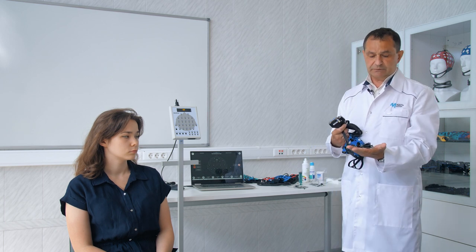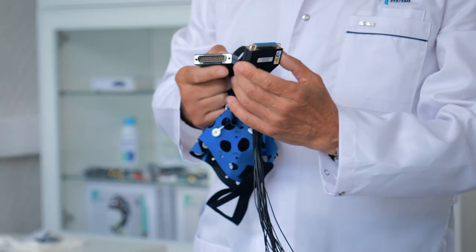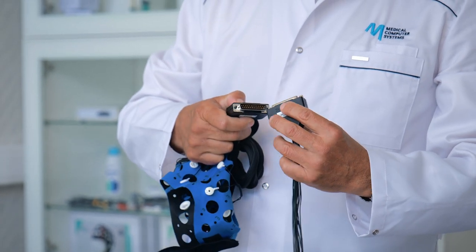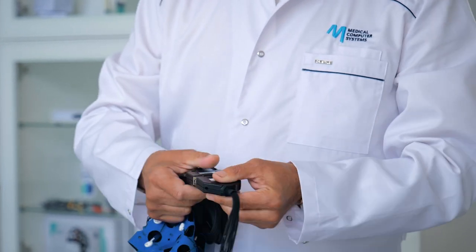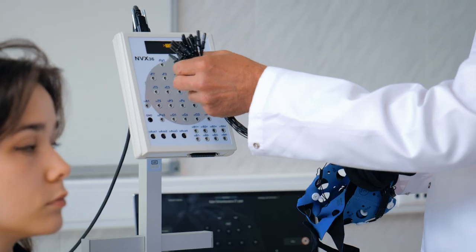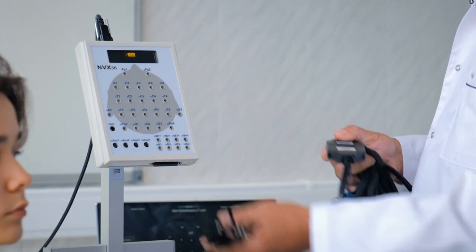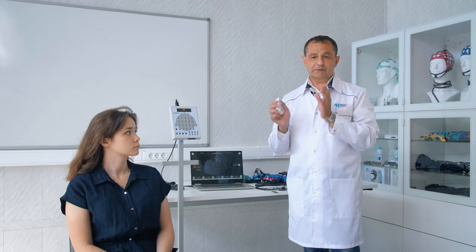In the event that there is a requirement to register utilizing touch-proof type end plugs with a diameter of 1.5 millimeters, which is a widely accepted standard measurement, an adapter is utilized for this specific purpose, which easily connects to the common connector. Then we use separate forks which we insert into the sockets on the front panel of the electroencephalograph. We will record today through a common connector.